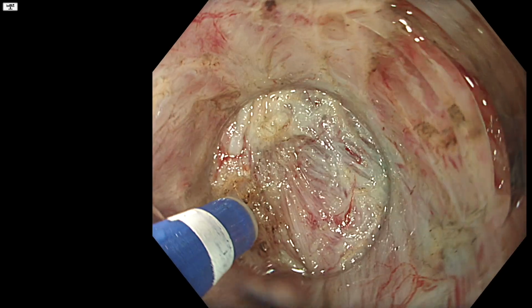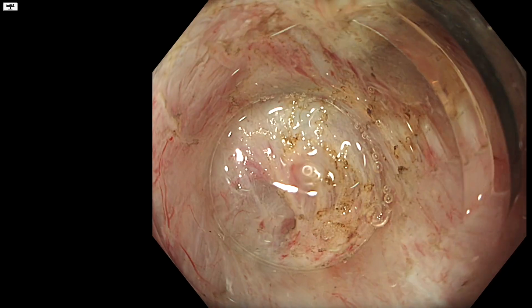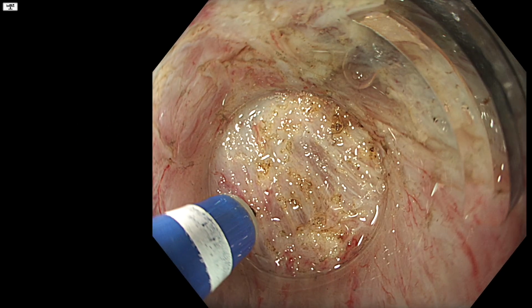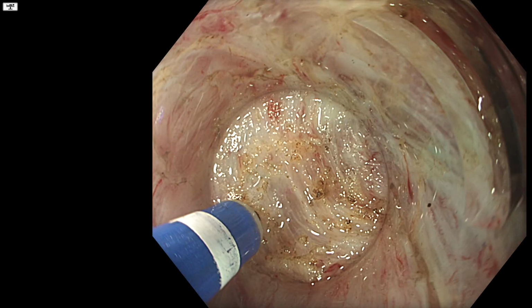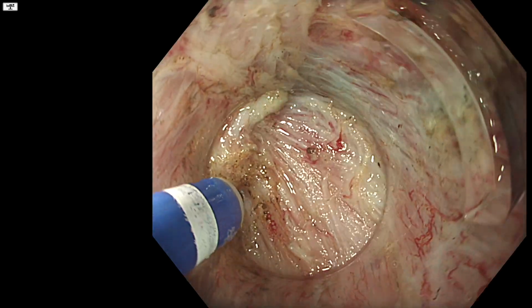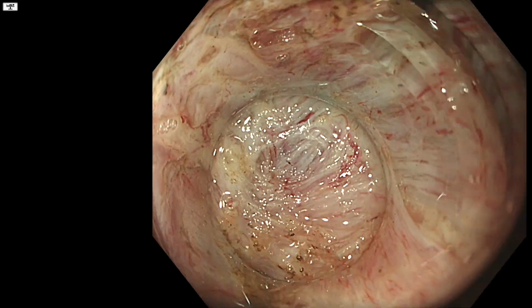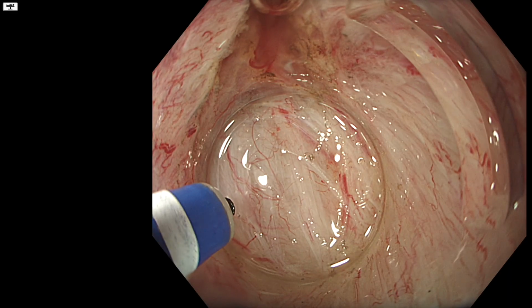EID, on the other hand, is performed endoscopically under deep sedation. It preserves the integrity of the rectal wall and keeps all future surgical options open. We also have the 3-year outcomes data from the Dutch group showing that cases with deep submucosal invasion and low risk features, which were managed with active surveillance after EID, of these 95% avoided rectal surgery at 3 years with 0 cancer-specific mortality.